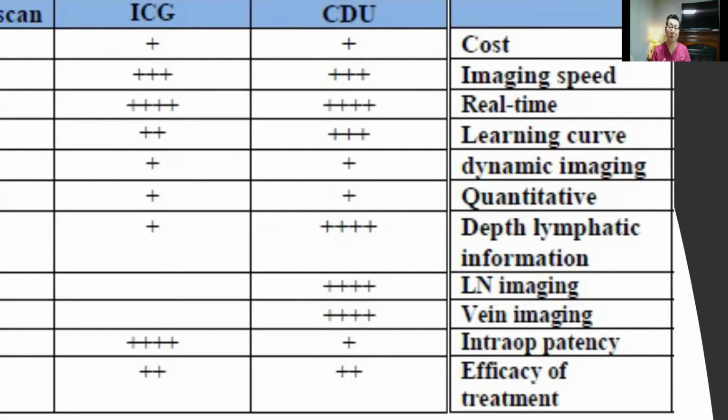And most of all, the most important point, I think the biggest advantage in using ultrasound, is that it has the ability to map out veins adjacent to the lymphatics. So by using the ultrasound, you're able to map out the adjacent vein and also the lymphatic vessels, and actually know where to make the incision in relationship with the vein and the lymphatic vessel.